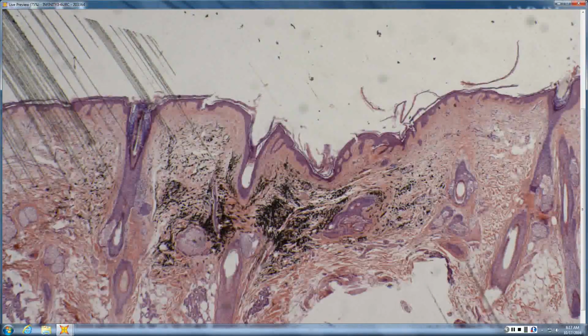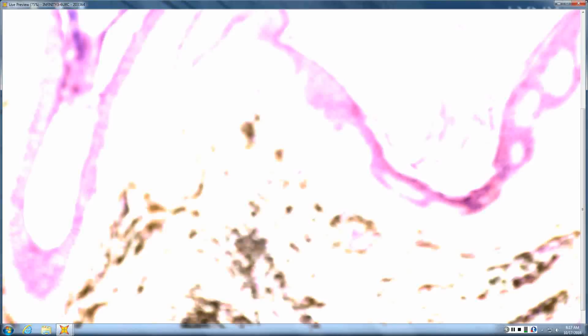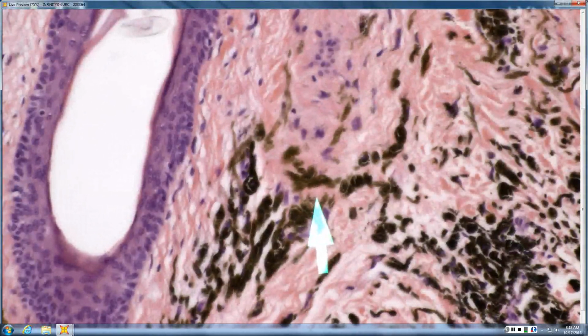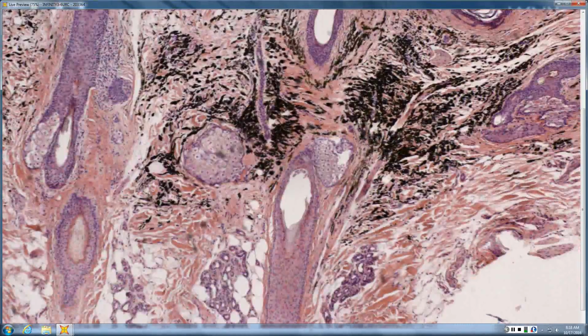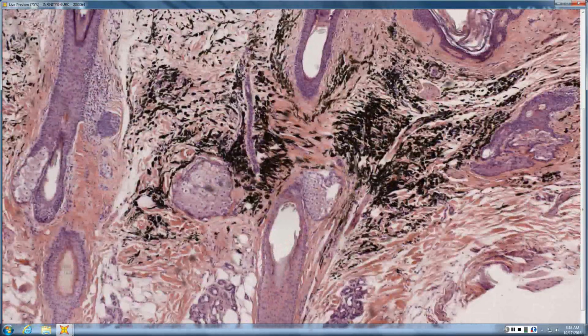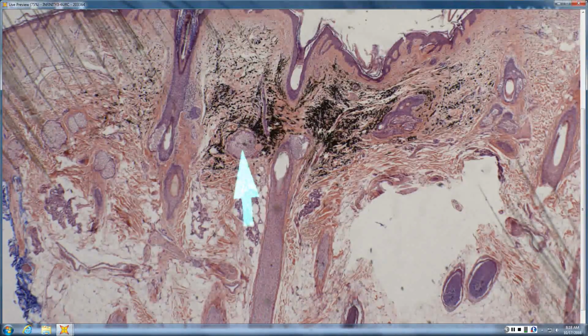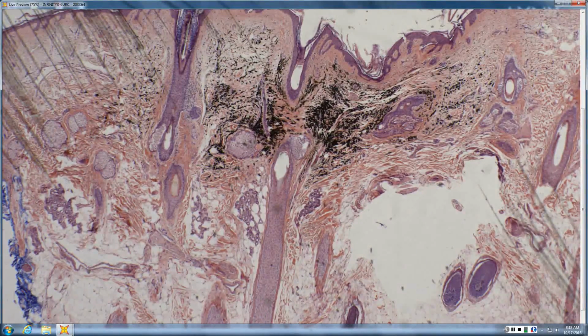There's some sort of pigment here in the dermis. Very dark. So you might think it could be tattoo pigment or it could be melanin. It's definitely brown. It's non-refractile, so it's not hemosiderin, so I'd say it's probably melanin. Many of the cells are dendritic. So a local deposit of heavily pigmented dendritic melanocytes on a scalp. First thing you look for is to see, does it have its own stroma? It's not jumping out at me.